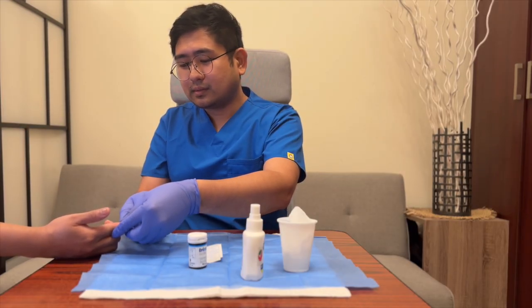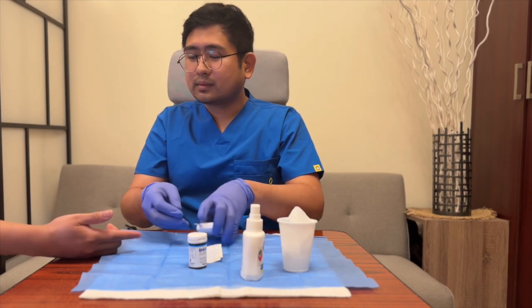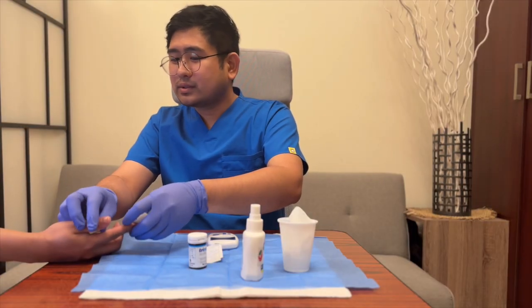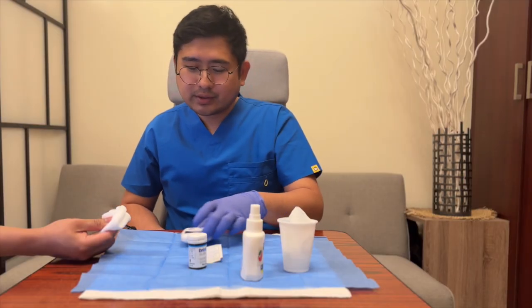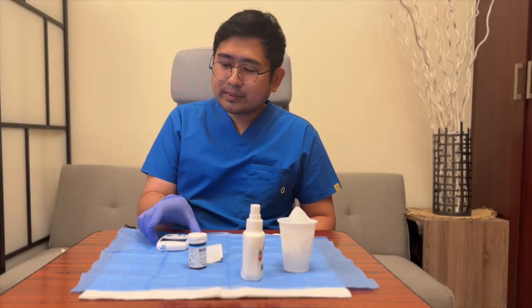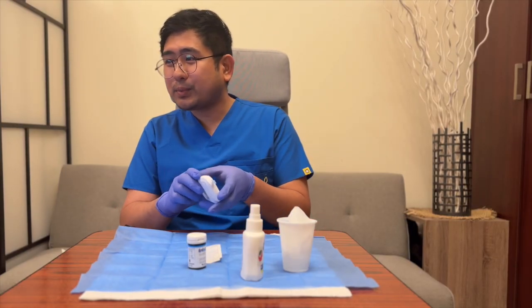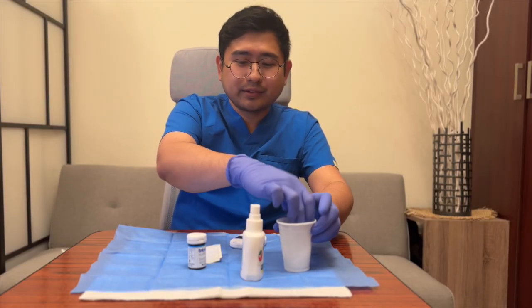Alright. So just keep it on hold and we'll wait for the result to appear. Alright, your current blood sugar is this. Alright, I'll go ahead and dispose of all the equipment and everything safely.